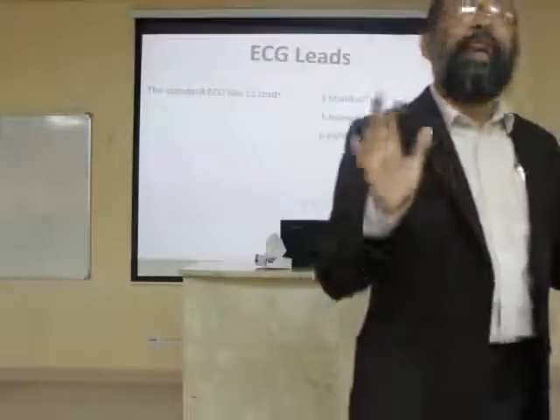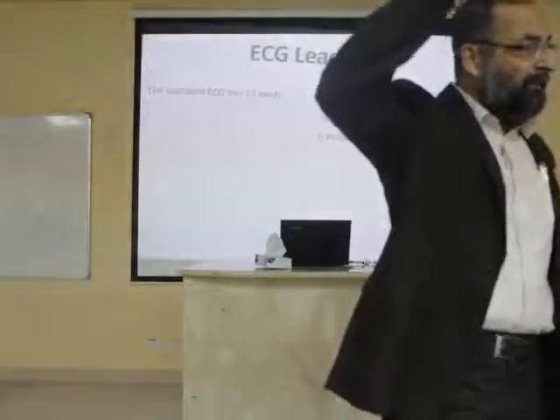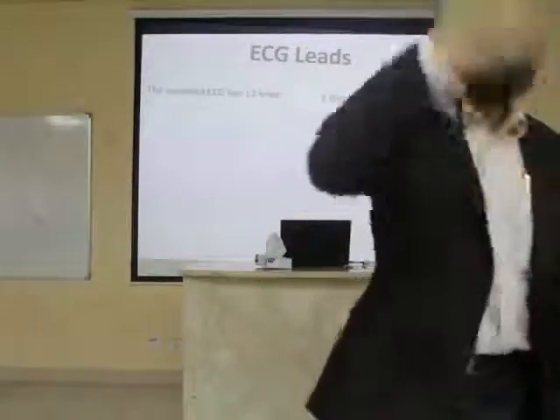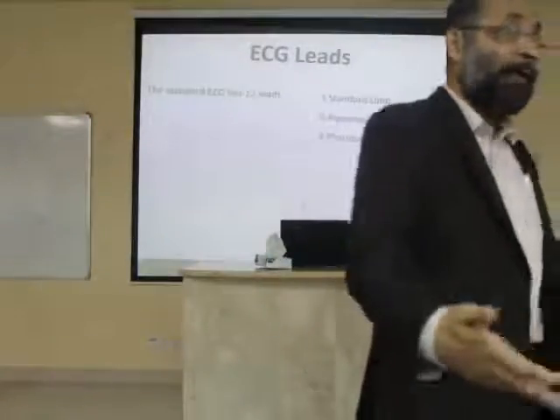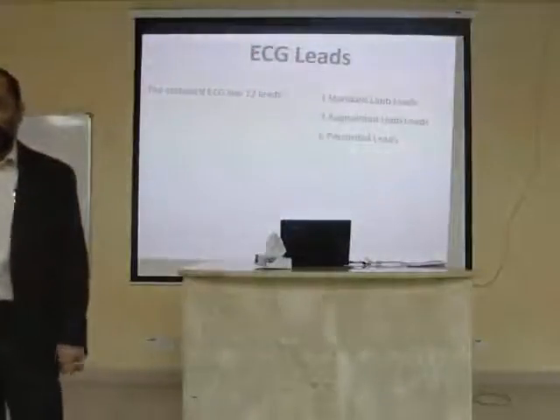When you use the term standard, in the history of ECG, the first ever developed leads were the bipolar leads, okay? And then we developed other unipolar leads, okay? So the standard leads originally are the bipolar leads, okay?